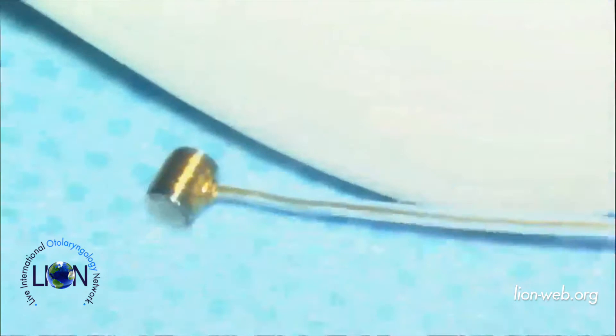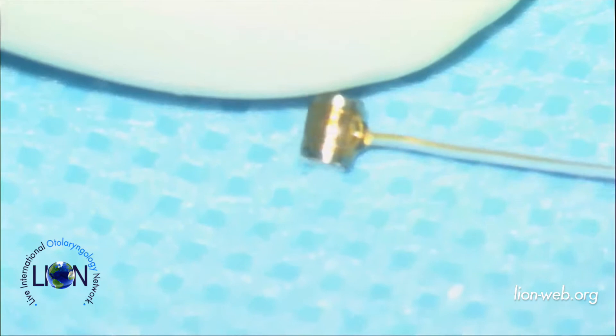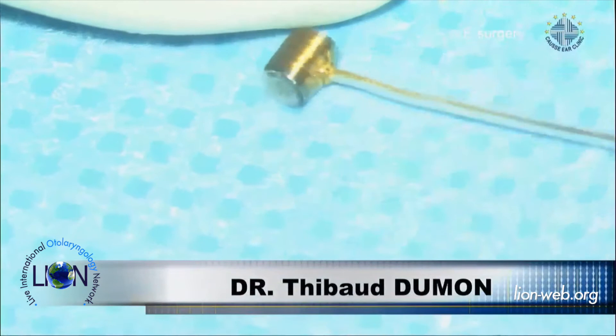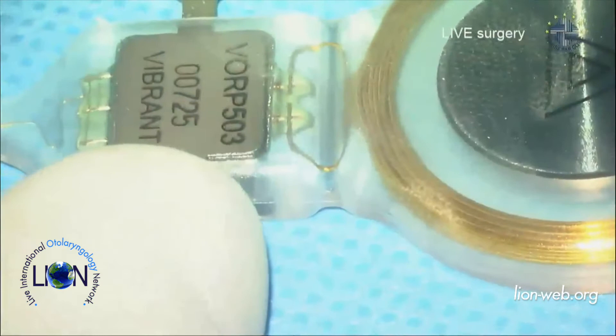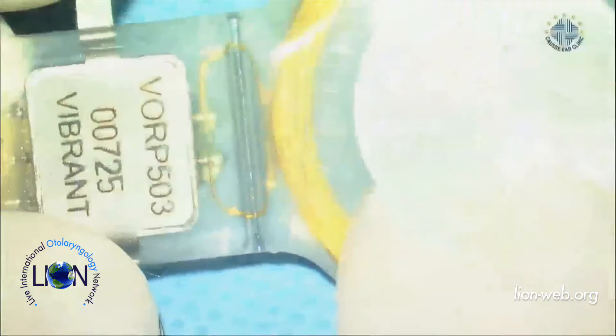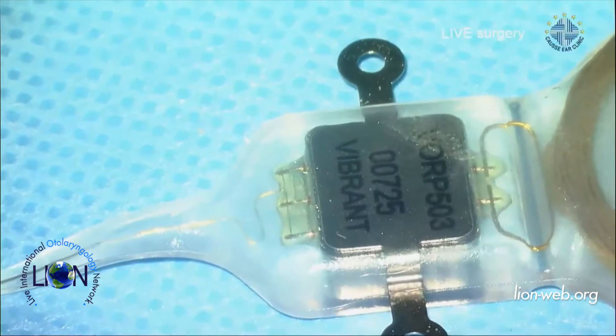Here you can see the floating mass transducer — the vibrator of the implant. On the previous Vibrant Soundbridge, the clips were directly fixed on the vibrator. On this new model, they are not. You can use different couplers to fit the vibrator in different locations in the middle ear. This is the demodulator and the receiving antenna. To make the implant MRI-safe, there are two magnets in opposite polarity that cancel each other under a magnetic field. There are also two little legs to fix the implant with screws into the cortical bone.